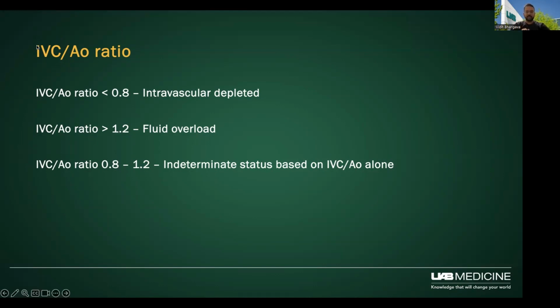And so again, I think there is some value in these extremes of data in patients with just pure volume issues or hypovolemia or hemorrhagic shock. But outside of that, again, for all the reasons we talked about, similar to IVC ratio, IVC diameter alone, this doesn't really work.